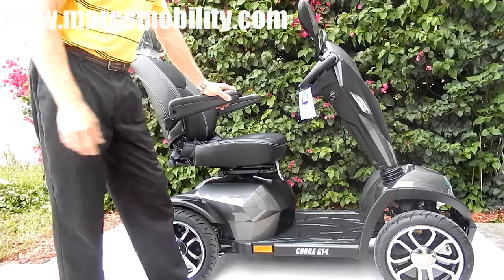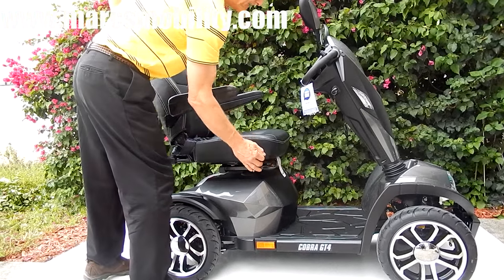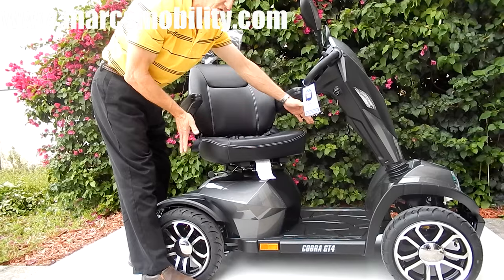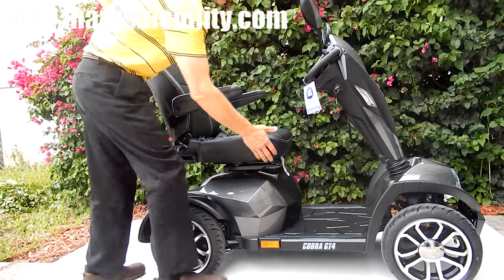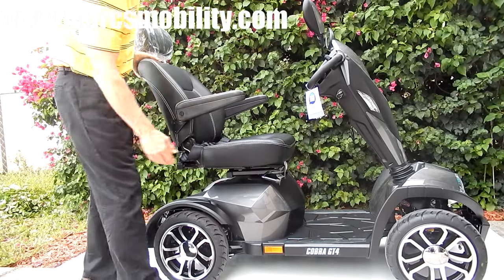Also, this scooter has headlights and taillights. It does have a swivel seat. Now, the seat on this scooter right now is 20 by 20, but it also comes in 22 by 20. You can also move this seat forward and back depending on which position you need.